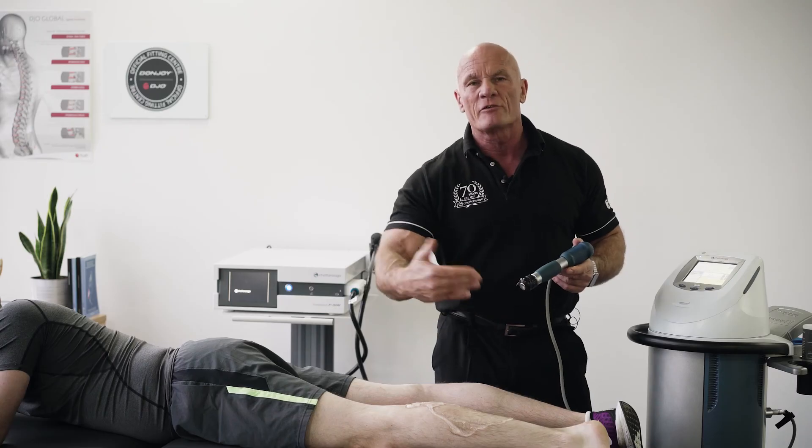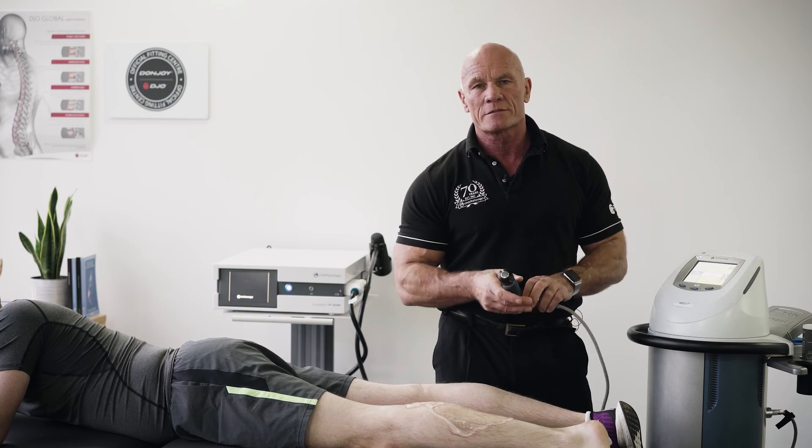After you finish your treatment, repalpate to ensure that the problem is corrected. You'll find it.